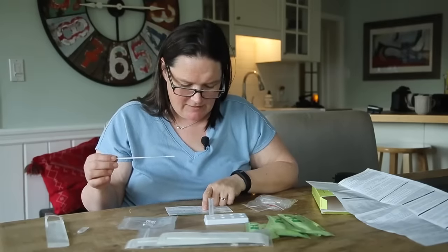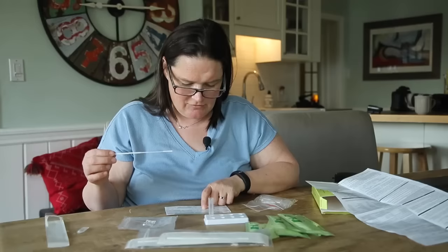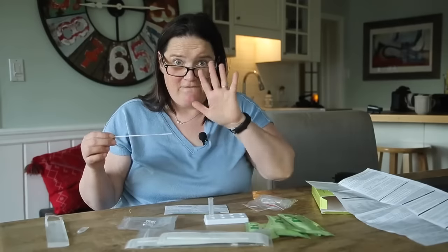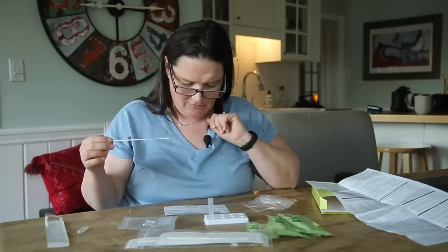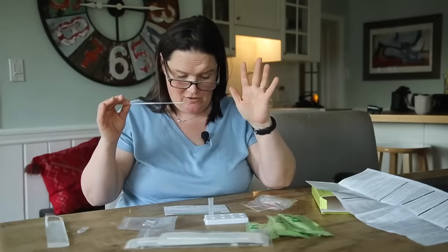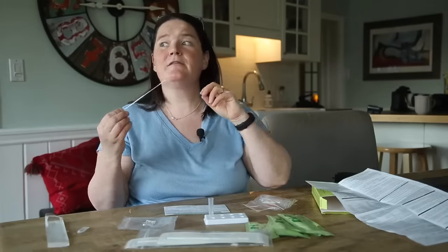Tilt patient's head back 70 degrees. Insert the swab through the anterior nares into contact with the nasal septum at least 0.5 inches inside the nostril until mild resistance is encountered at the middle. Using a circular motion, the nasal orifice should be swabbed for a minimum of five seconds. Compress the nostril with the fingers to trap the swab, and tip and rotate the tip for a minimum of five seconds. That's 10 seconds in your nose. Remove and repeat with the other nostril with the same swab — so it's going to be 20 seconds total.